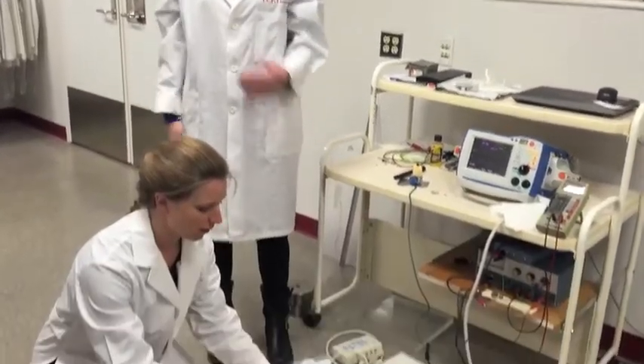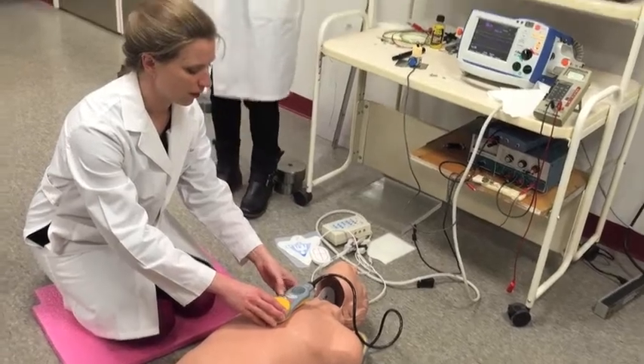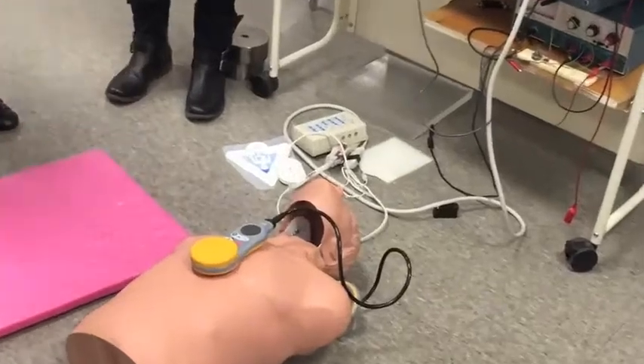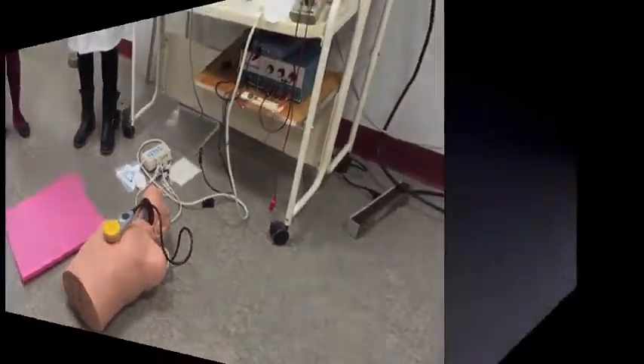That adds a whole other step to the post-event review process. One of the things our clinical helpers told us was that the review afterwards is really important for organizations to get better at giving CPR, so the workflow is a big part of what we're really studying with these devices.